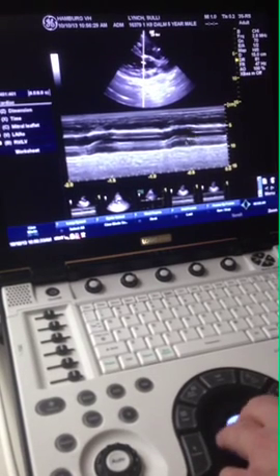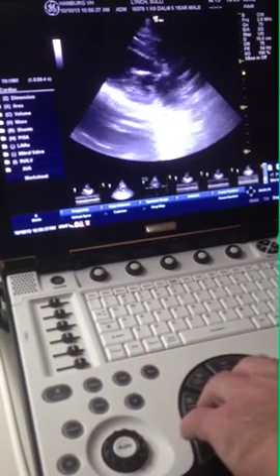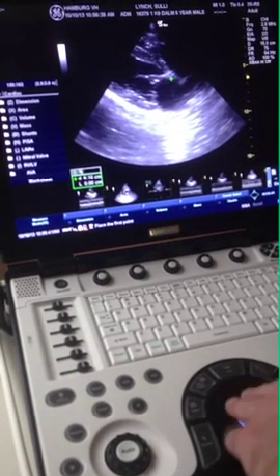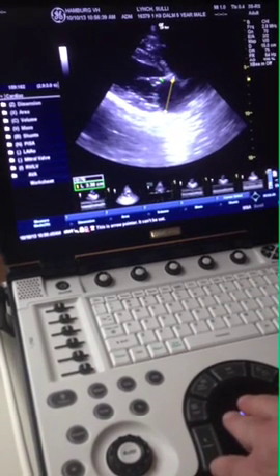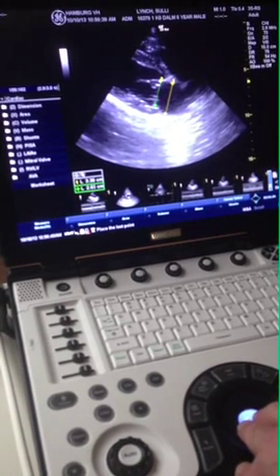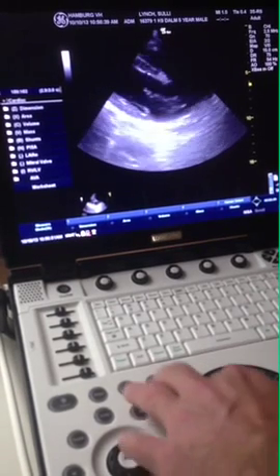I'll get my Jobb LA to AO with the aortic valve right in the middle — valve opening, valve closure — and save that. Then go back to four-chamber and get LA max. I'll take my measurement parallel to the mitral valve annulus. You can make an imaginary line through the mitral valve annulus and make sure that you're parallel between the two lines. Save that.